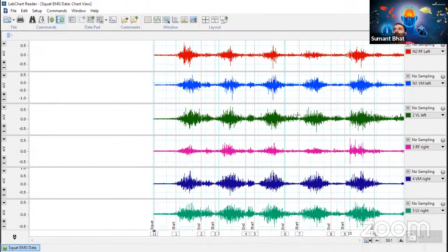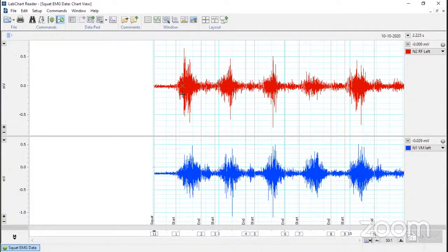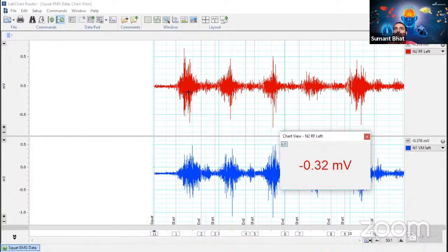This is the example data, which also has some comments — you can see 'start', 'squat', 'start', 'end', and so on. You can see the amplitude when you take the cursor to a particular point. The challenge with EMG data is that many people ask whether we can take an average of this EMG signal.